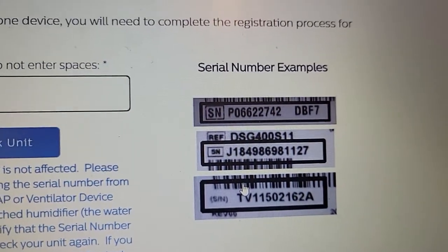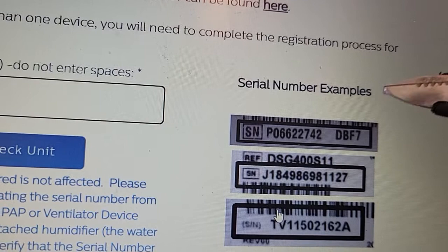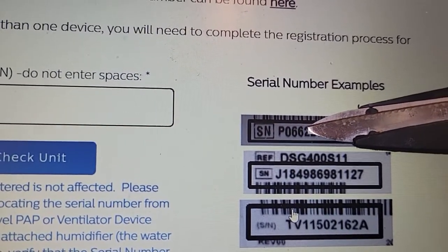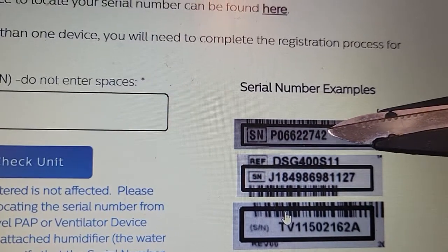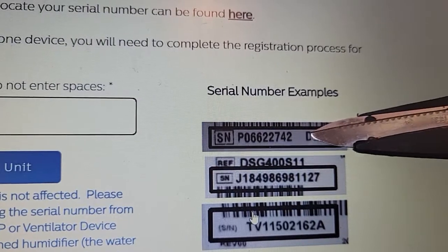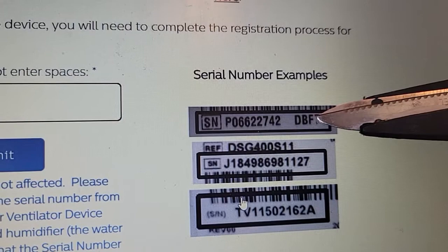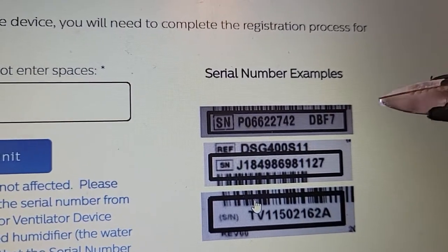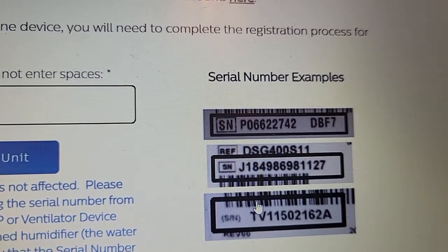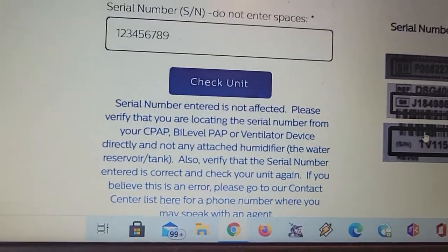Here are some examples of serial numbers. The first ones are similar to the A-flex and C-flex units. If you see here, it's P0-6-6-2-2-7-4-2, and then there's a space — do not enter that space. And then it's the letter D, and that looks like an 8F7, but it's actually DBF7. Make sure you study your unit carefully to get it in there correctly. My A-flex and C-flex units are under recall.